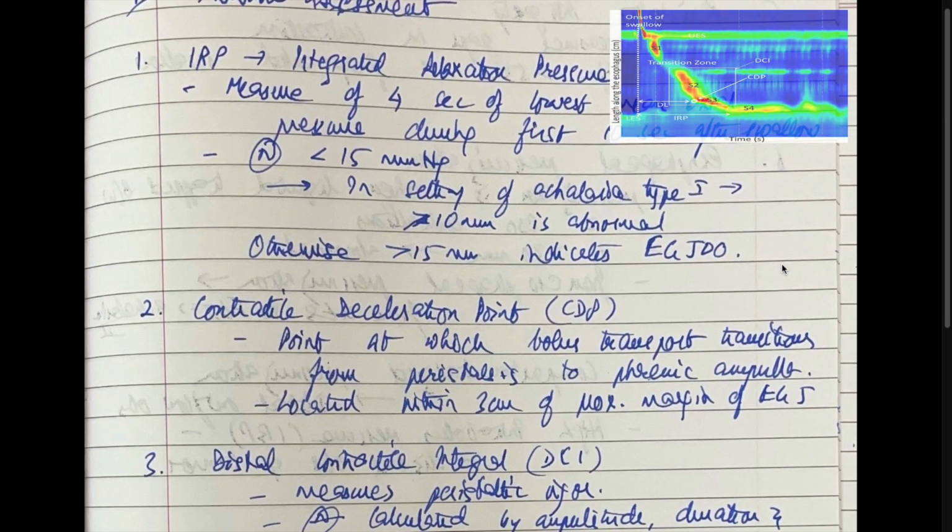Then we do a swallow assessment, and there are these measures that we take. First is the IRP, which is integrated relaxation pressure. It's the measure of 4 seconds of the lowest mean axial pressure during the first 10 seconds after a swallow. The normal is less than 15 millimeters of mercury. In the setting of achalasia type 1, we have to use 10 millimeters as the cutoff. Otherwise, more than 15 millimeters indicates an EGJ outflow obstruction.